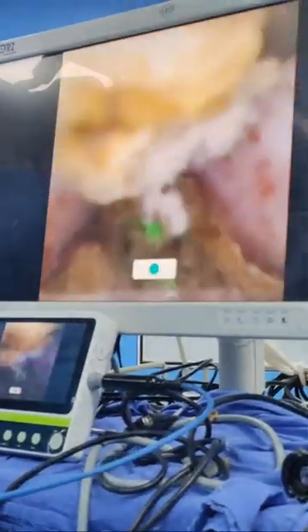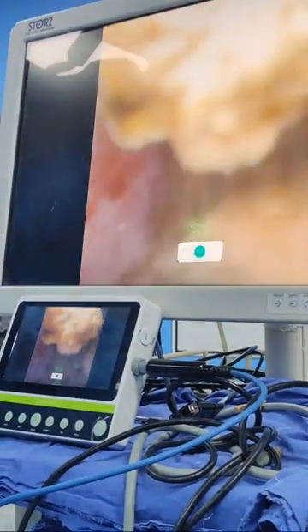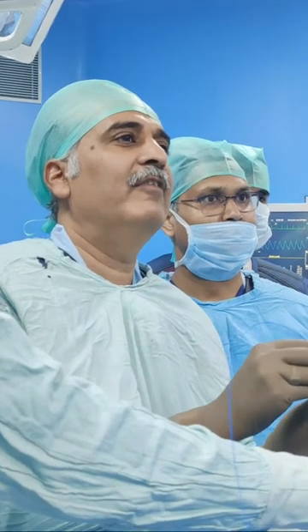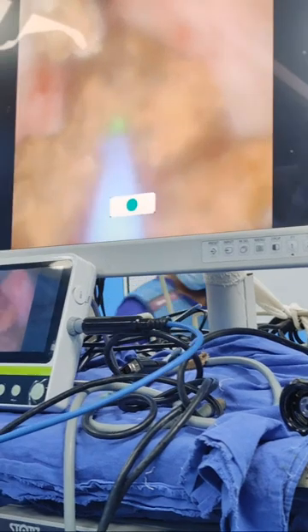So you are using beautifully lasering a staghorn stone? Yeah. I remember doing it at Faridabad, and it was such a nice experience with this. So we thought that we will. So this is how the stone gets sucked in the bottle. And you don't have to remove the scope completely.